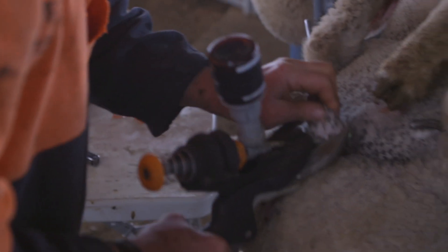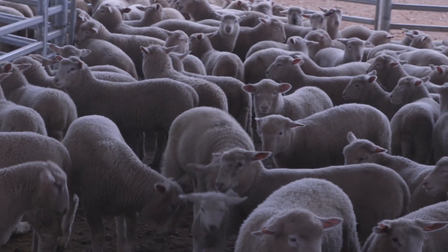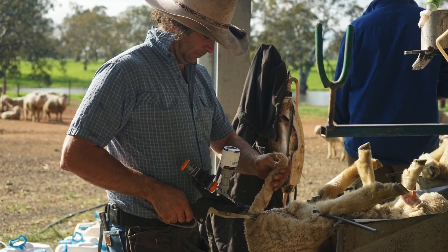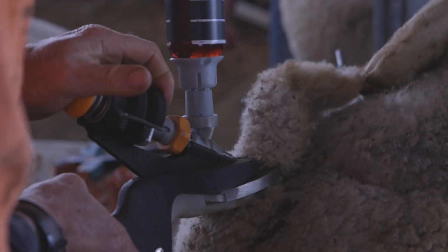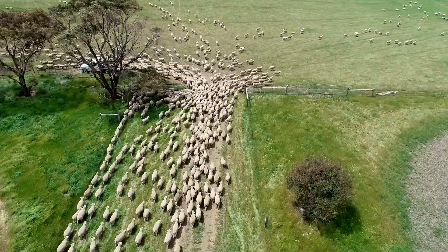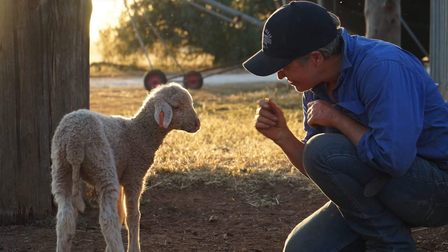We've been developing and testing the prototypes out here in the farm environment, and we've helped relieve the pain that would otherwise have been felt by thousands of lambs during our trials. The farmers and contractors we've worked with have picked up the process of using the new tool very quickly — it's not slowed down the marking of the lambs, and we're really getting positive feedback from them. Happy lambs, happy farmers.